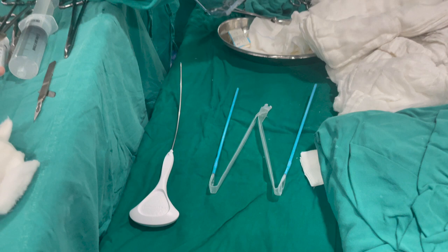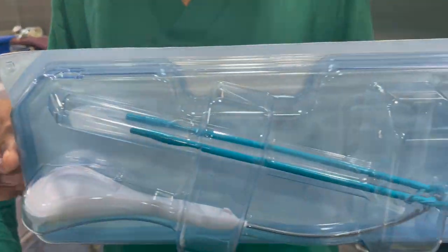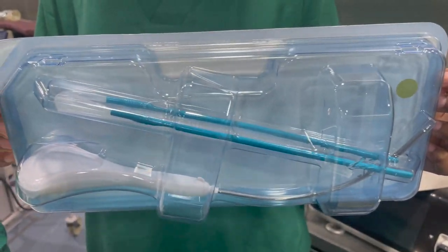At the end of the procedure, only a part of the polypropylene macroporous mesh will remain in the body. The rest of the things are single-use and are cut and thrown at the end of the surgery. Thus for every patient a new set is used, and the part that remains in the body is only part of the mesh.